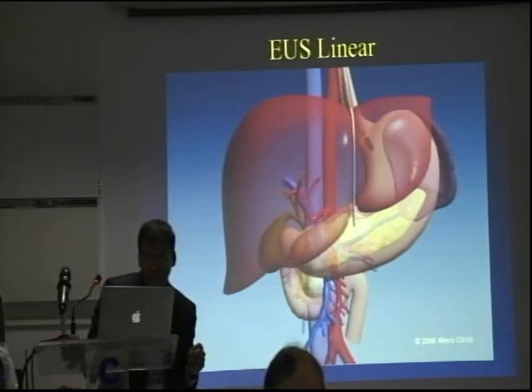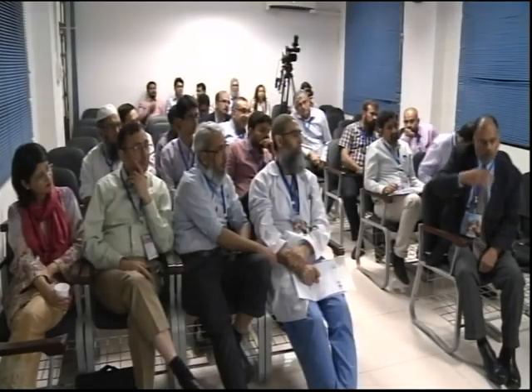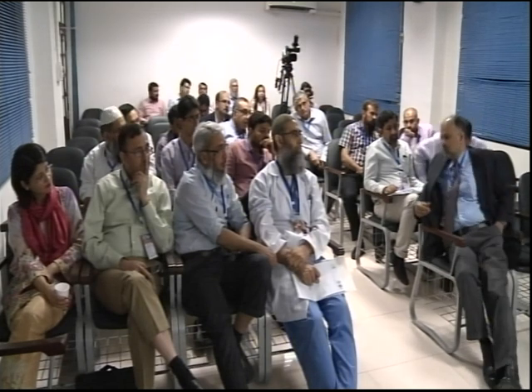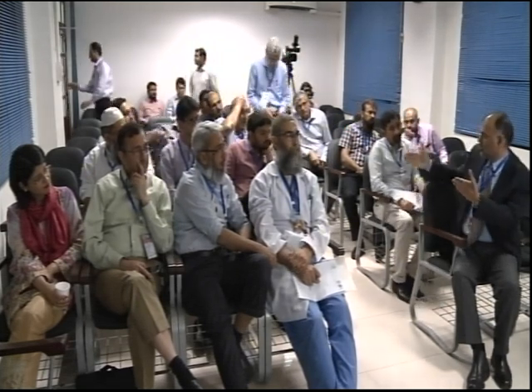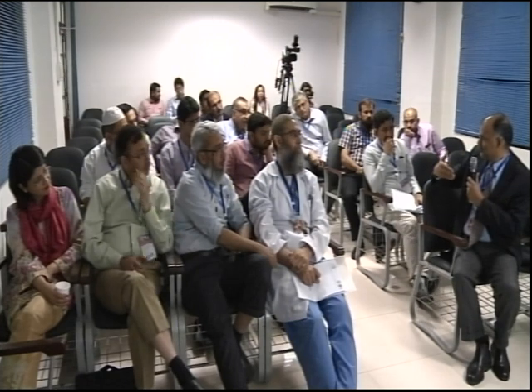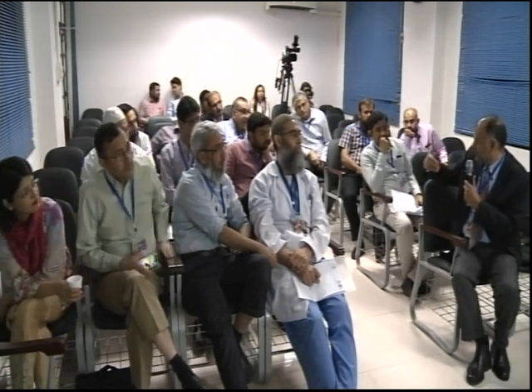Yes, I think most of the time this orientation is as Khalid has said. The best way I found was to imagine the patient is lying on his side, right, on his side. If you have the head on this side, and imagine the scope is going like this, facing posteriorly, what will you have? You will have the aorta, right?